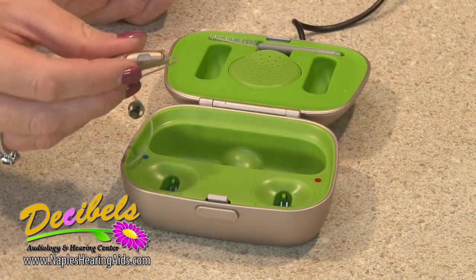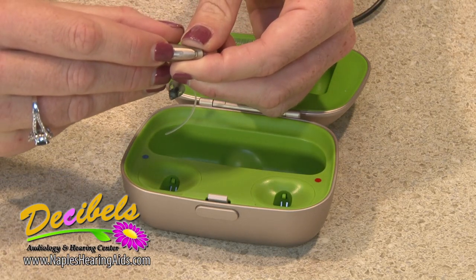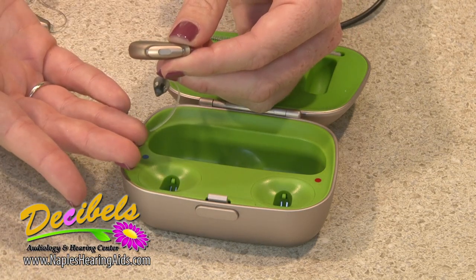Be sure to turn on your devices when you take them out of the case. You can do this by holding the button for three seconds or until you see one green flash.